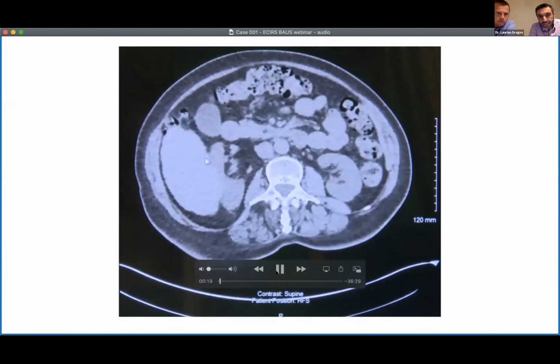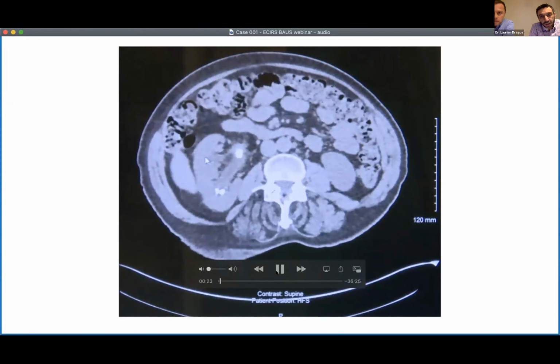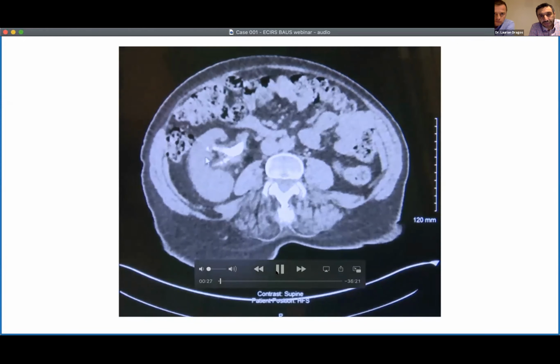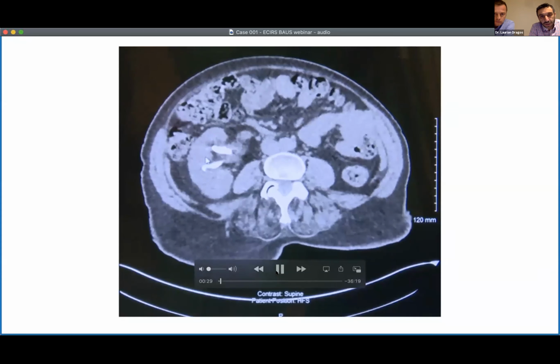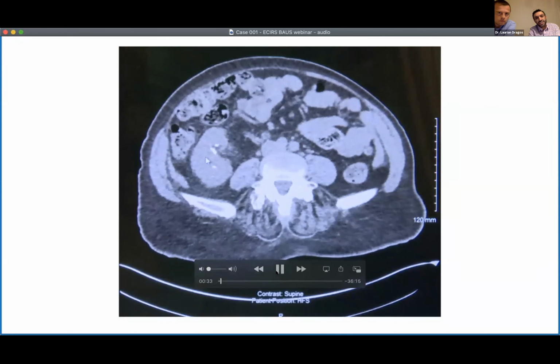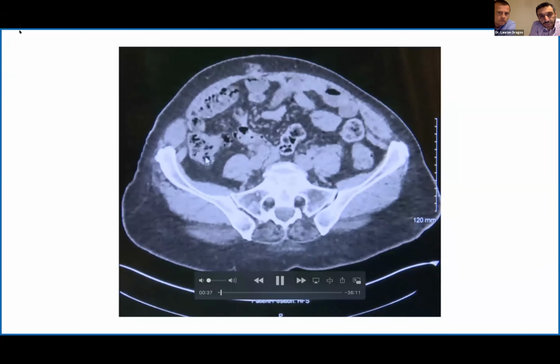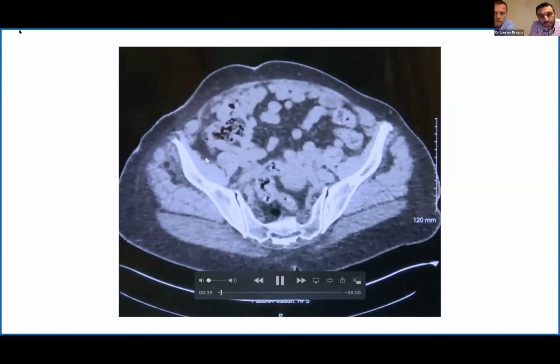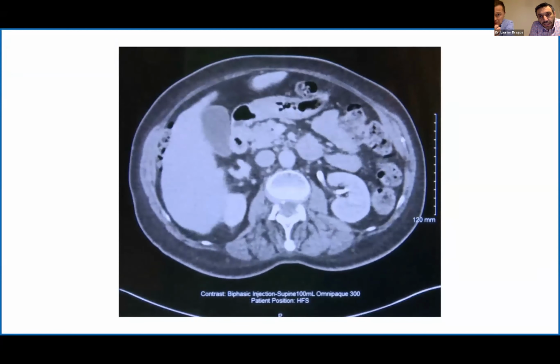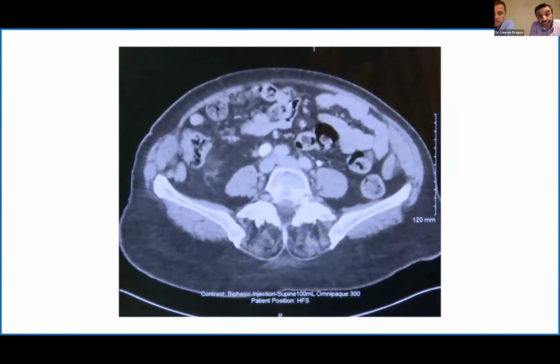So she underwent a flexible cystoscopy. In our department, the policy is that a patient with a high risk of malignancy will have a CT with contrast, provided that the renal function is adequate. As you can see, this patient has stones extending in both the mid and lower calyces. There is also some calcification in the upper pole. The contrast CT does not show any other abnormalities.